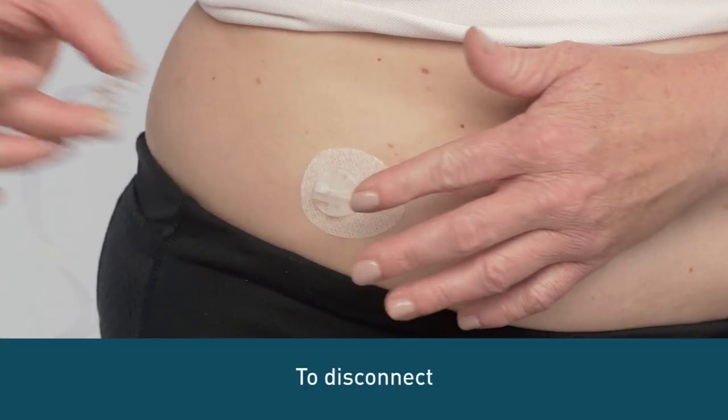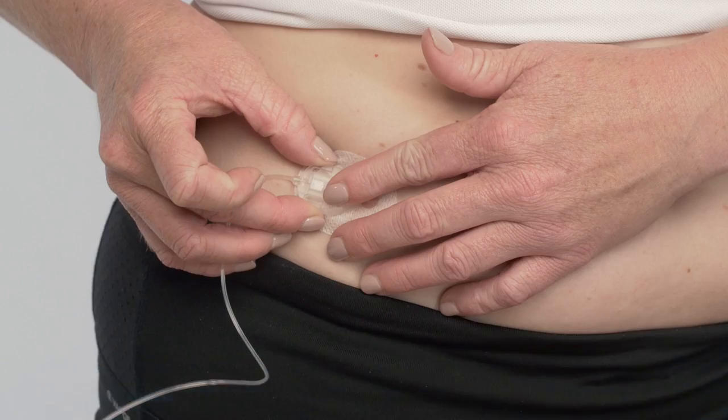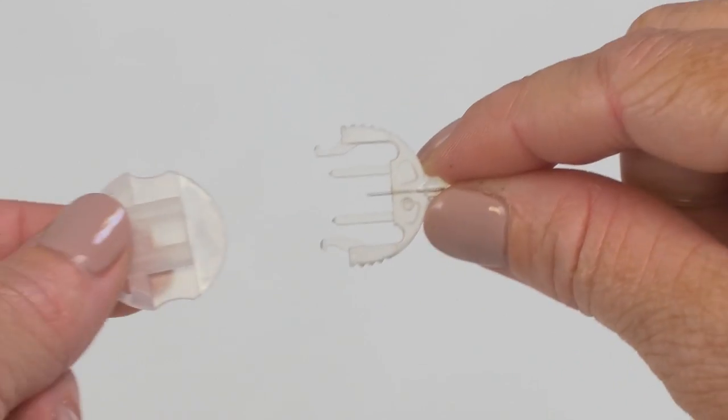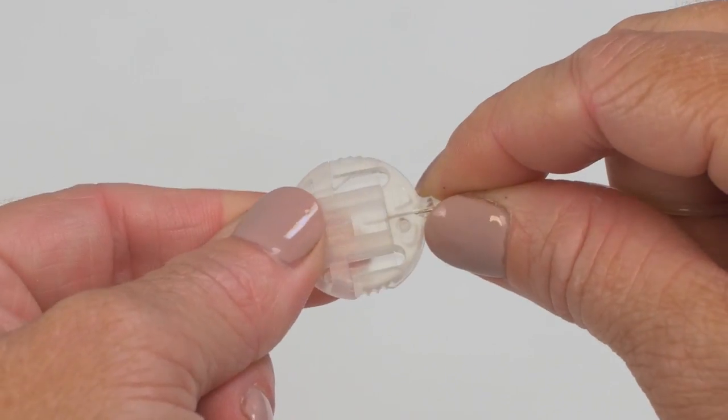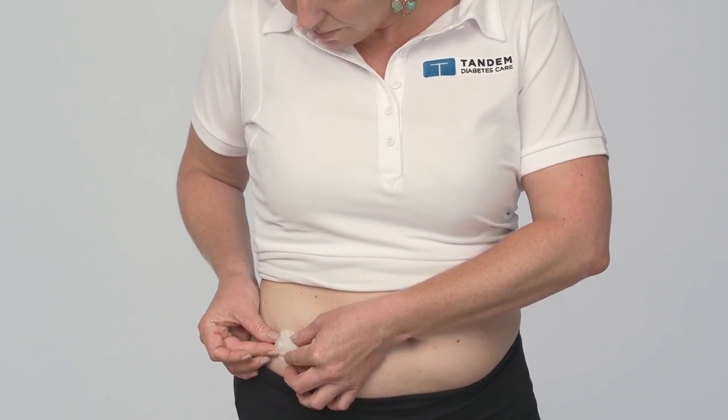You may want to temporarily disconnect from your pump at times such as showering, swimming, and contact sports. To do this, always disconnect from your site by gently squeezing the side tabs and pulling the end of the tubing off the cannula housing while holding the tape with your other finger. Cover the connector needle with the circular protective cap and insert the disconnect cover into the cannula housing until you hear a click.